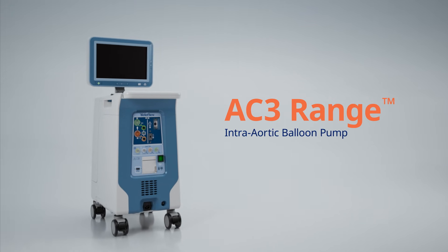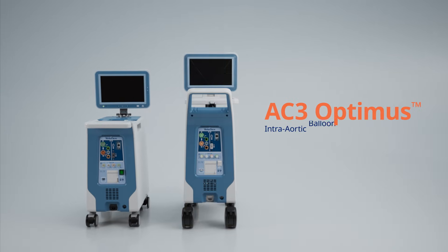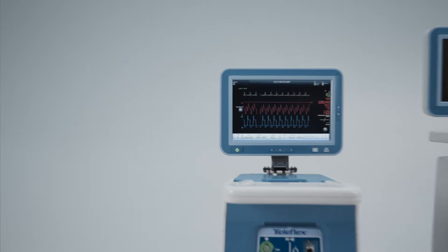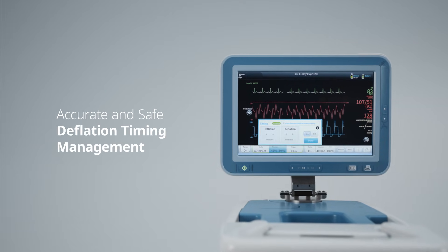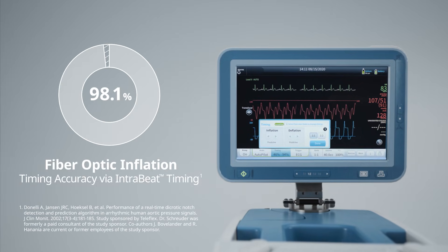Introducing the AC3 Range Intra-Aortic Balloon Pump from Teleflex, leveraging the award-winning design of the AC3 Optimus IABP in a transport-ready design. Featuring the same simple interface and proprietary algorithms by providing optimal trigger selection, accurate and safe deflation timing, and 98.1% fiber optic inflation timing accuracy.